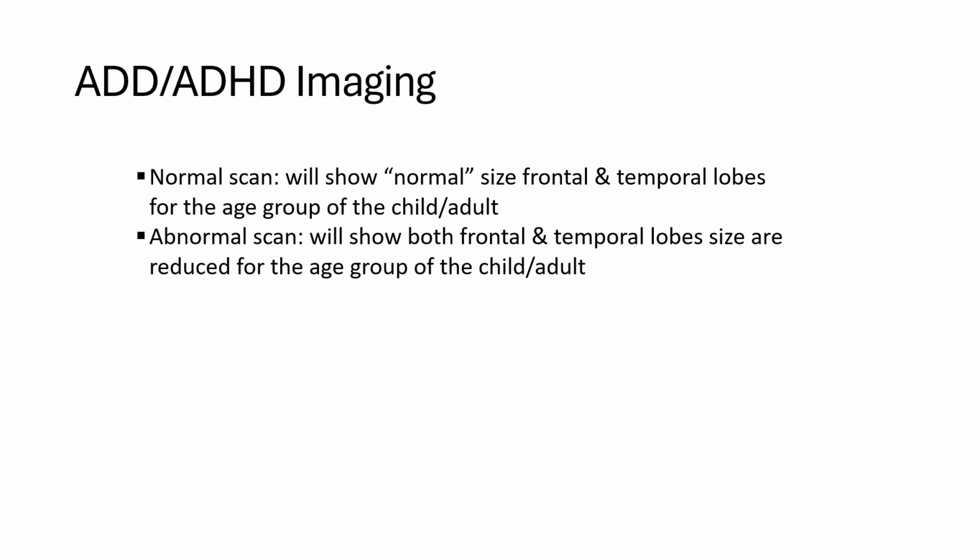When SPECT imaging is used, it's used with Ceretec. With FDG, it's about 5 millicuries of FDG, and then the patient is scanned about 30 minutes to an hour after injection. A lot of times the protocols just follow the normal neuro-oncology protocol, doing an FDG brain scan.